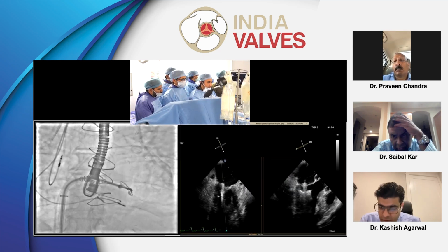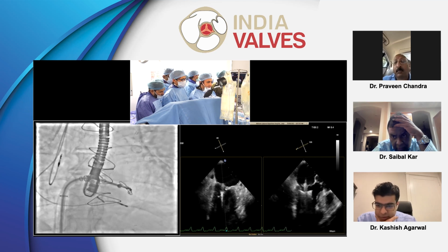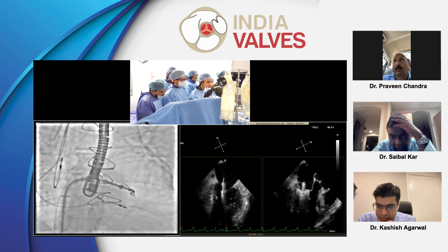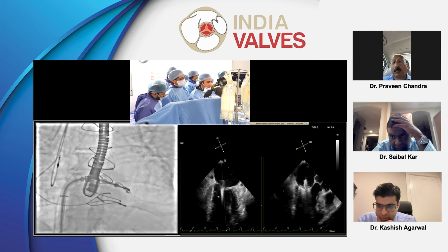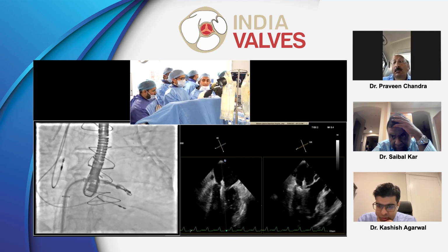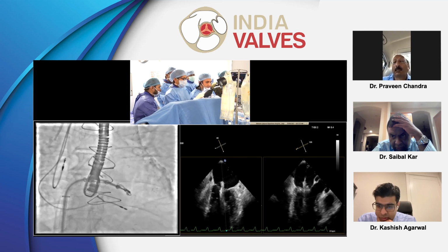There you see the flail. Actually, I saw it for a second. I think it's behind the mandrel. Behind. That's what it is. Come back, pull back, the mandrel that's connected to the clip. Yeah, keep coming up. So I'm going to pull back. Very good. You can see nice. I can see AML, PML resting on it. Drop the grippers, please. Pull out a little more and you drop it. Good. Okay. So you can see the bounce.